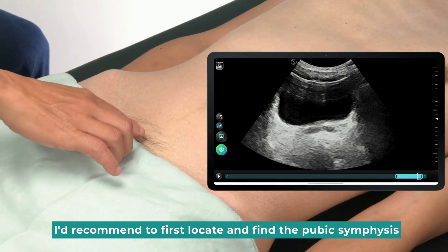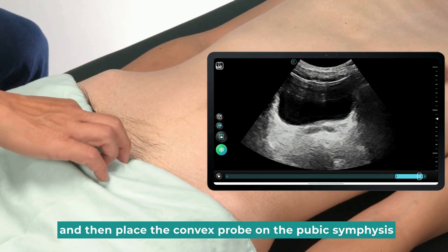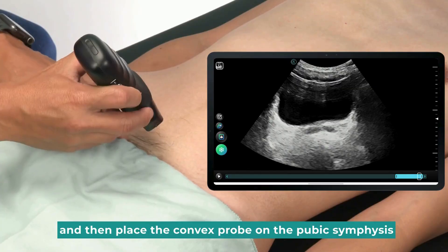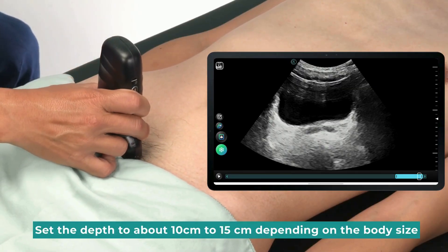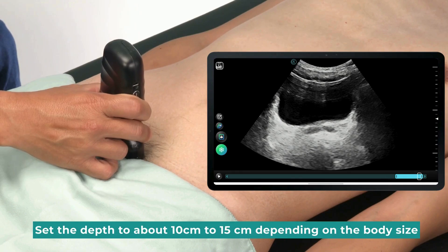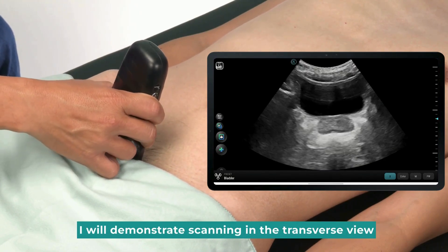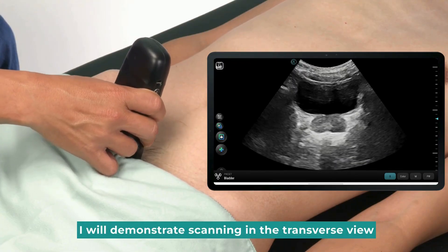I recommend first locating the pubic symphysis and then placing the convex probe on the pubic symphysis, ready to start the scan. Set the depth to about 10 cm to 15 cm depending on the body size of the patient. I will demonstrate scanning in the transverse view.